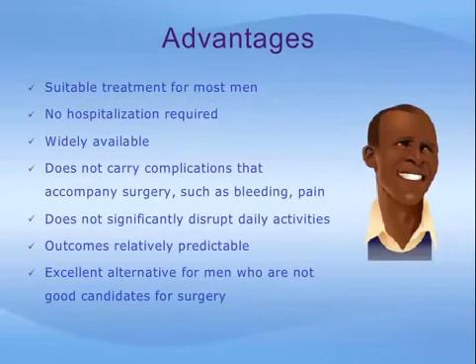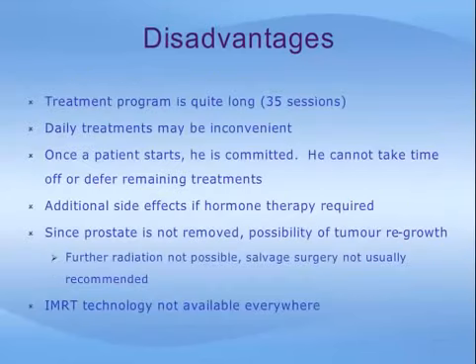External beam radiation therapy is a suitable treatment for most men with prostate cancer, since it can treat a wide range of prostate cancers. No hospitalization is required. It is fairly widely available. It does not carry the standard complications that accompany surgery, such as bleeding or pain. Treatment does not significantly disrupt daily activities, and outcomes are relatively predictable. External beam radiation therapy offers an excellent alternative for men who are not good candidates for surgery.